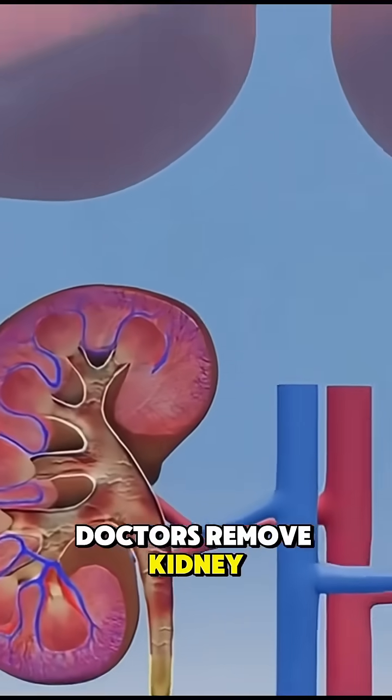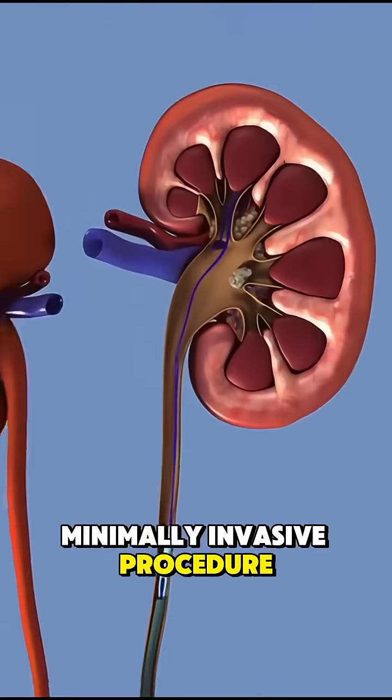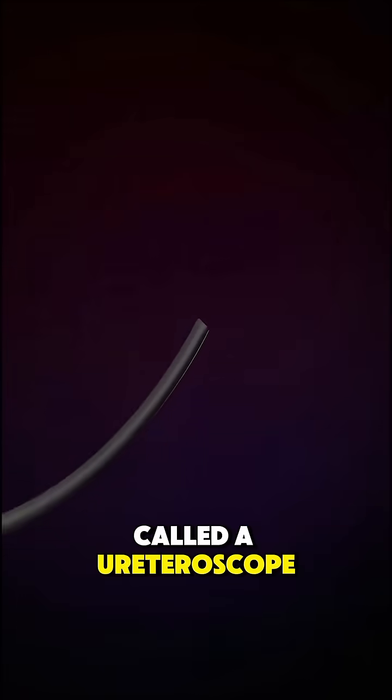Wondered how doctors remove kidney stones without making a single cut? Ureteroscopy is a minimally invasive procedure designed to clear stones from the ureter or kidney using a thin, flexible tube called a ureteroscope.